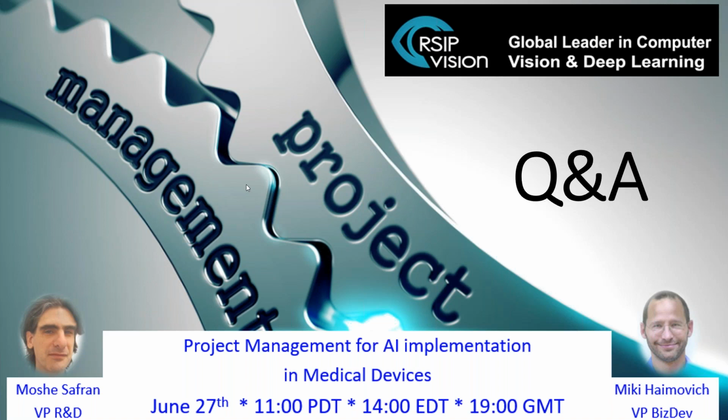For example, we created a whole C++ based foundation. This is not a deep learning based project. This is a parametric model based project. We have a very complicated cost function and an optimizer that's minimizing this cost function using a model based approach to fit a certain model of a medical body to very challenging data, and we created an entire C++ framework in order to represent this cost function, to compute all its derivatives, to do the optimization, and to get to the result. And this obviously sped things up by a few orders of magnitude relative to the original solution in the higher level languages.